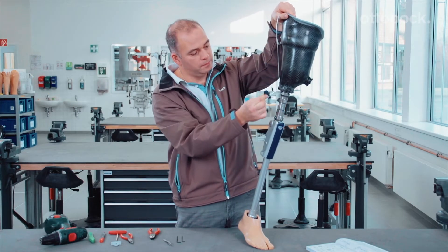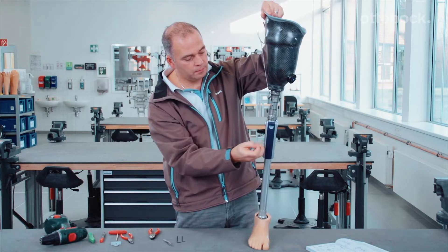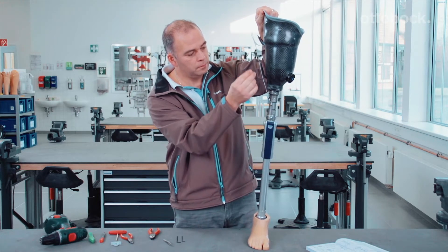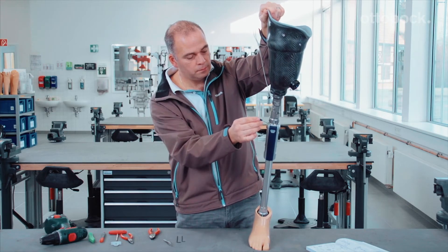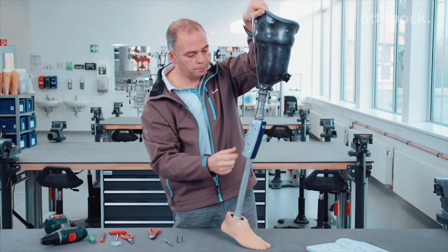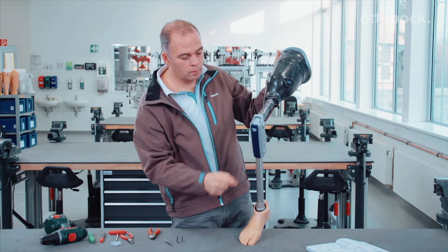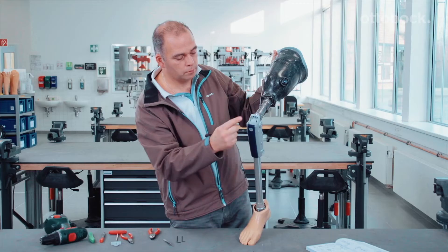The lock release cable of the 3R31 Procedo Prosthetic Knee Joint can be adapted to the amputation side of the user. The following video demonstrates how the individual steps should be carried out. Please ensure that the lock release cable of the knee fits the amputation side of the user in order to ensure the best possible unlocking functionality with the lowest possible pulling force. If this is not the case, the routing of the lock release cable can be changed.